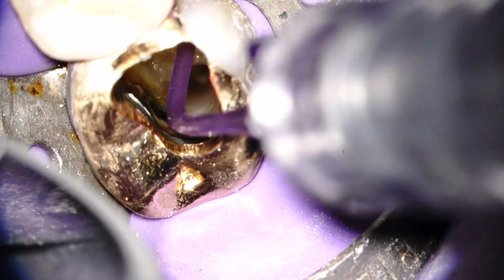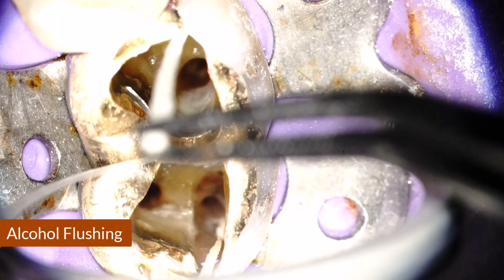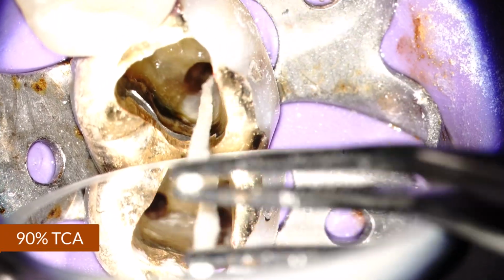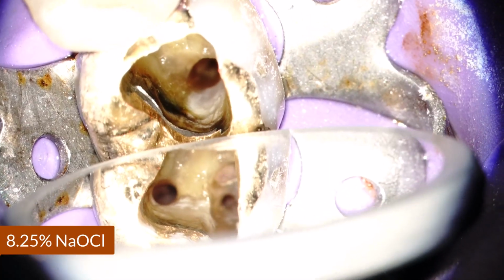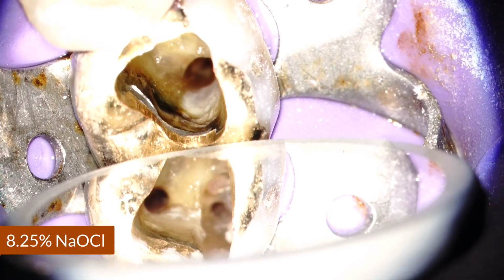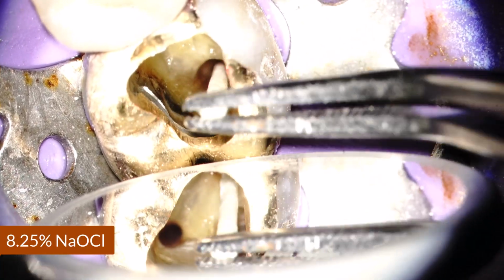Let's review the final canal clearing sequence before filling the canals. First, I flush with alcohol, then evacuate with the microsuction. Next, I place TCA, then I add bleach to the TCA to get the desirable chemical reaction products. Then I evacuate the bleach with the microsuction.